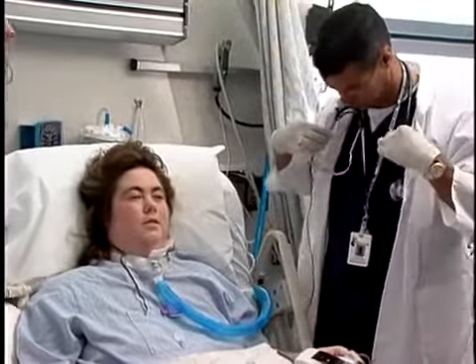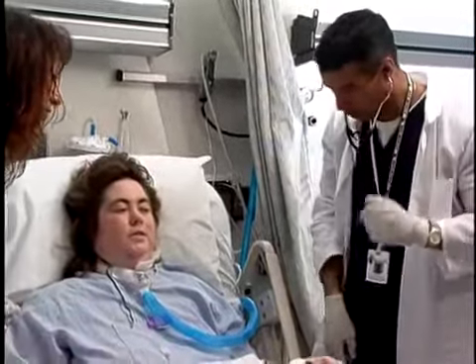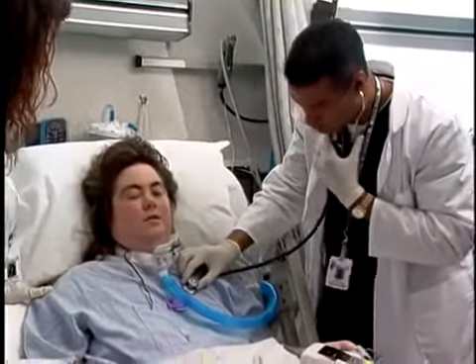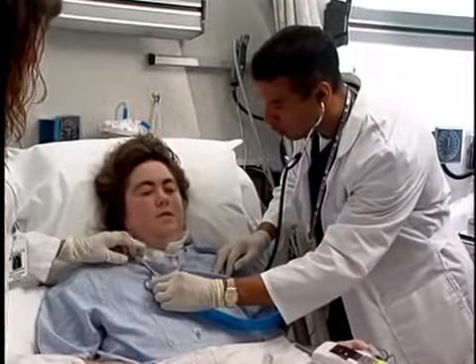Ideally, patients will gradually reach the point where they can tolerate the valve during all waking hours. It should be noted that due to a patient's fluctuating respiratory status, for example, presence of infection or thick secretions, his or her tolerance of the valve could vary from day to day and week to week.